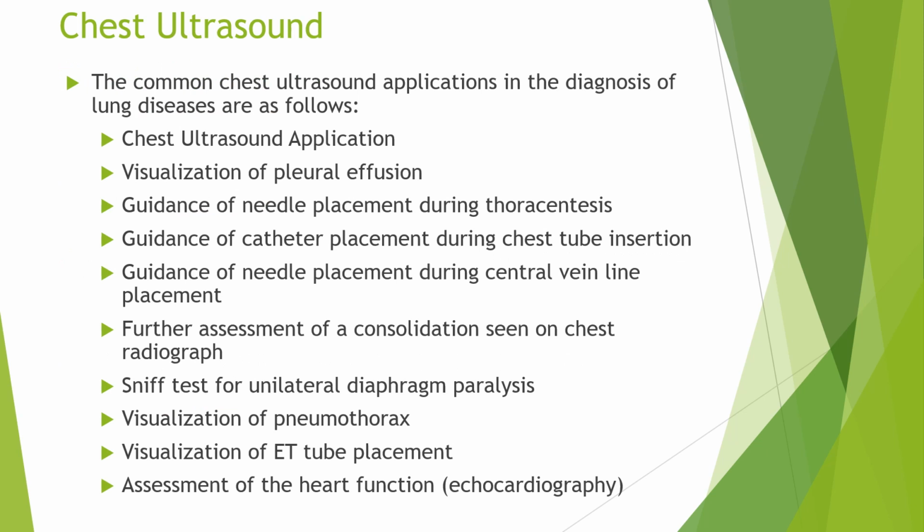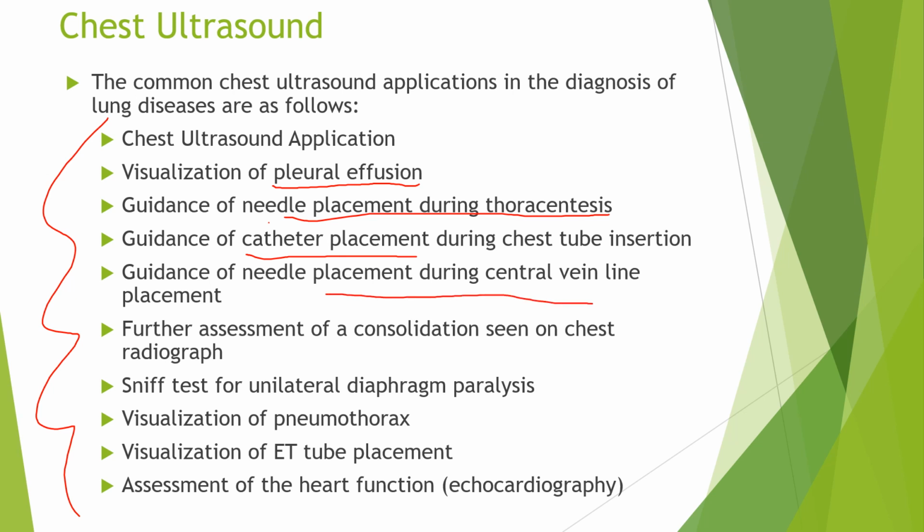So advantages, applications. You can see why I'm so happy and giddy about RTs going into this. A lot of applications, right? You can see if there's a pleural effusion and how big it is, right? You can actually use it for needle placement during thoracentesis, so we can mark where they would do this. They can use it for catheter placement during chest tubes, right? We can make sure it's going to the right place. They can use it for putting in central lines. That's just something our RTs do, right? Oh, thank goodness. I hope you guys are some of the people that want to go into stuff like this.